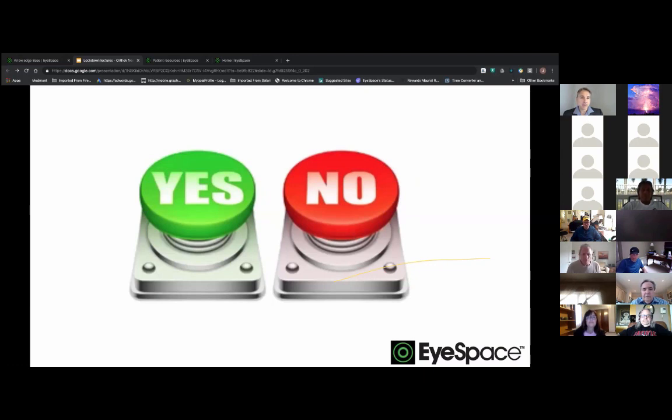You want to keep your astigmatism low. If you're doing with the rule, don't go beyond -1.50. If you're going against the rule, you might even want to drop that down to -0.75. We do know against the rules are a bit more difficult to reshape. So keep it simple, learn the craft. There's a lot more about Ortho-K than just designing the lens. It's the whole management of the process.